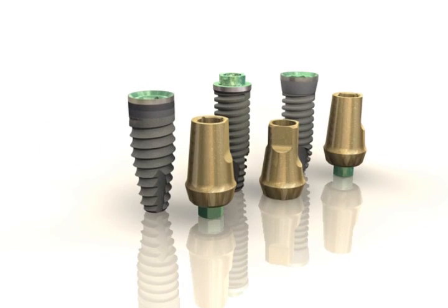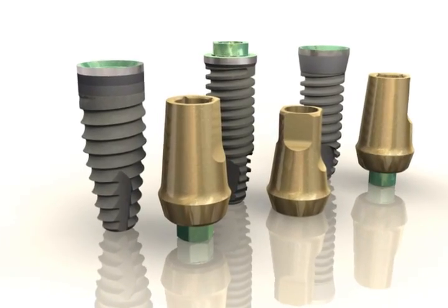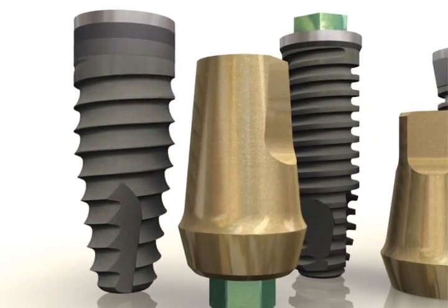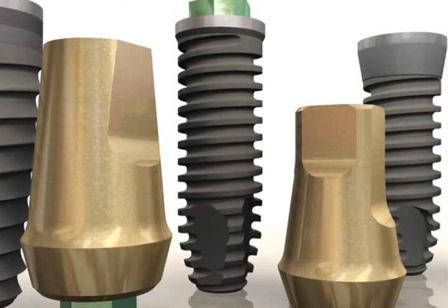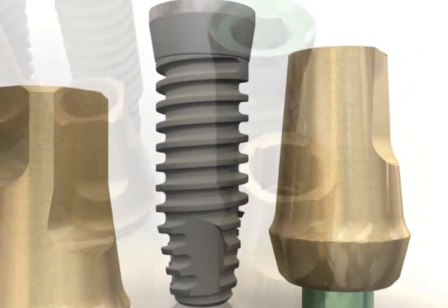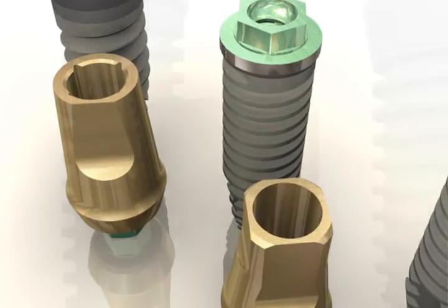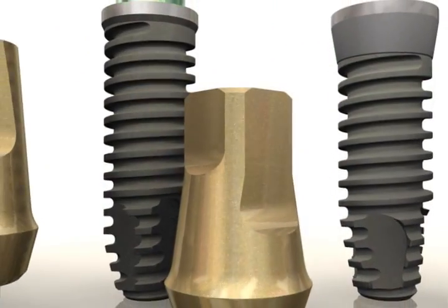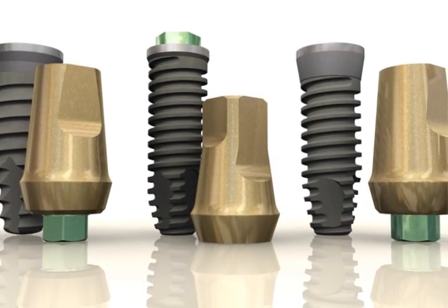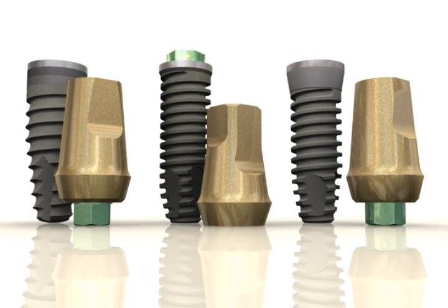The BioHorizons 3-in-1 abutment is a versatile abutment that enables clinicians to deliver and restore implants using a minimal number of components. Besides being used as an abutment, the gold-hued 3-in-1 abutment can also be used as a surgical mount and an impression component. This patented innovative solution comes packaged with every BioHorizons internal, external, and tapered internal implant, bringing tremendous value and simplicity to the surgical and restorative team.